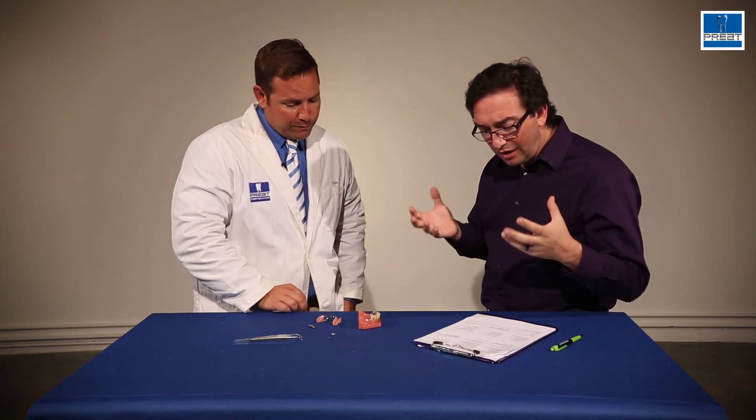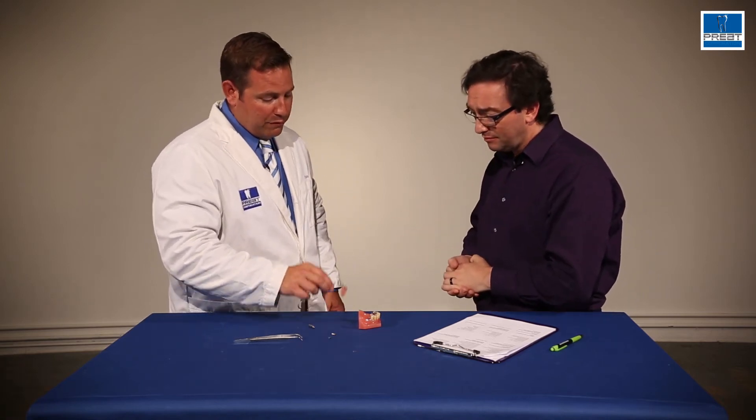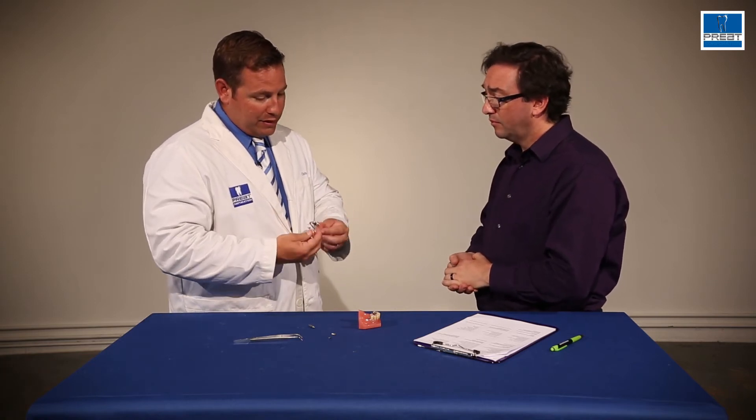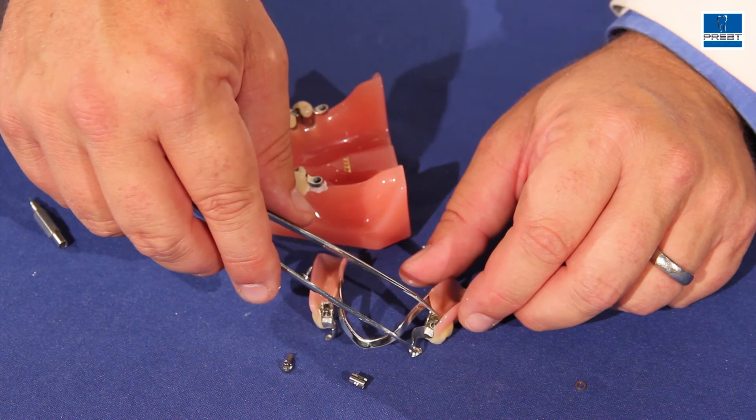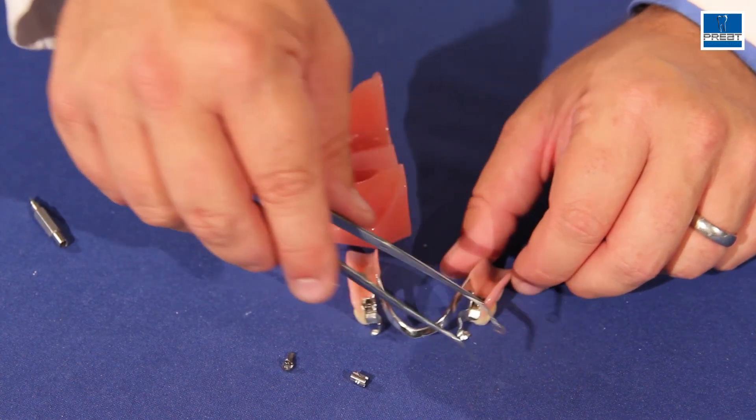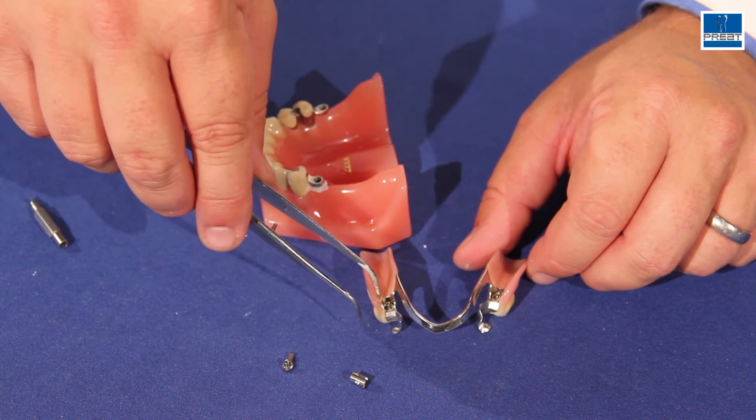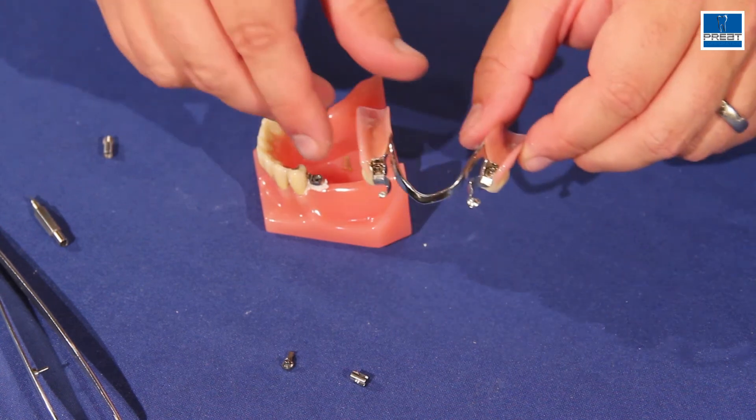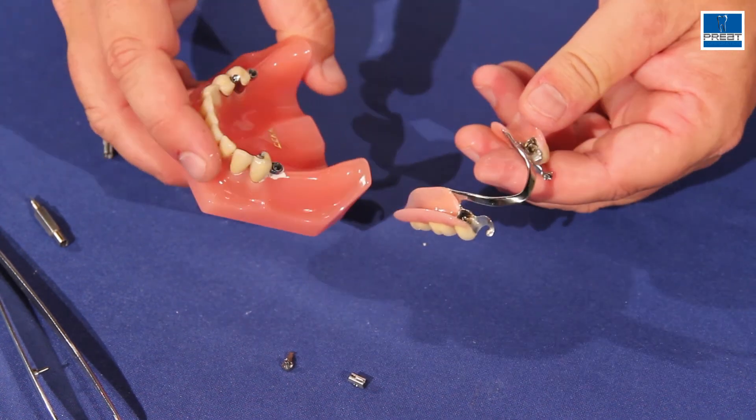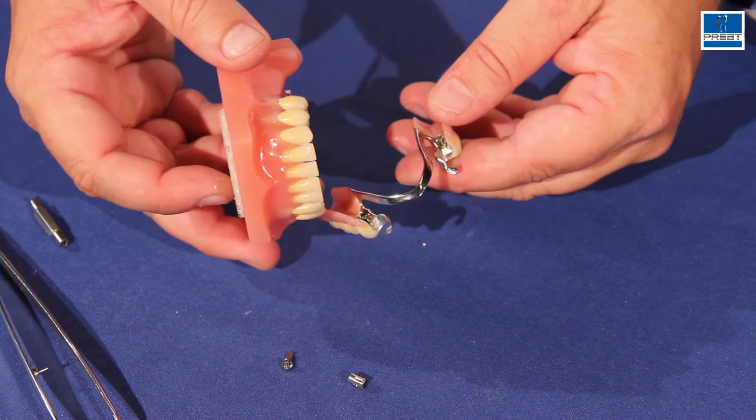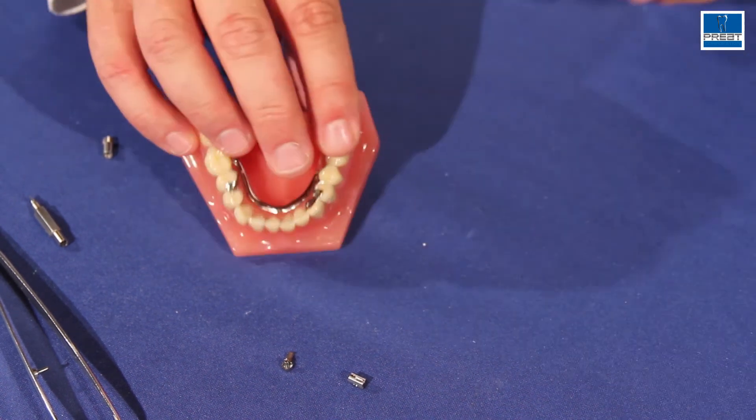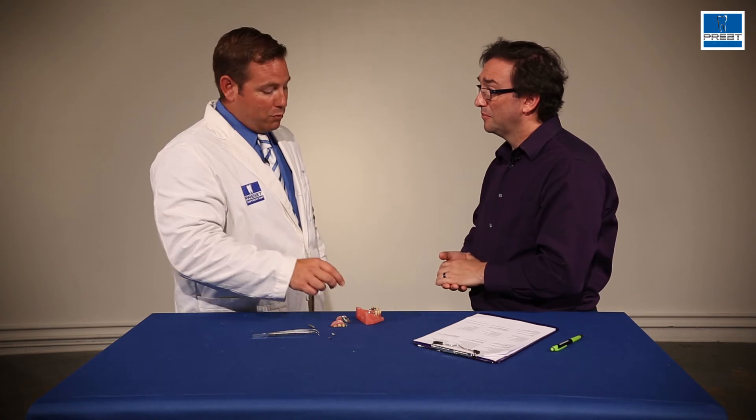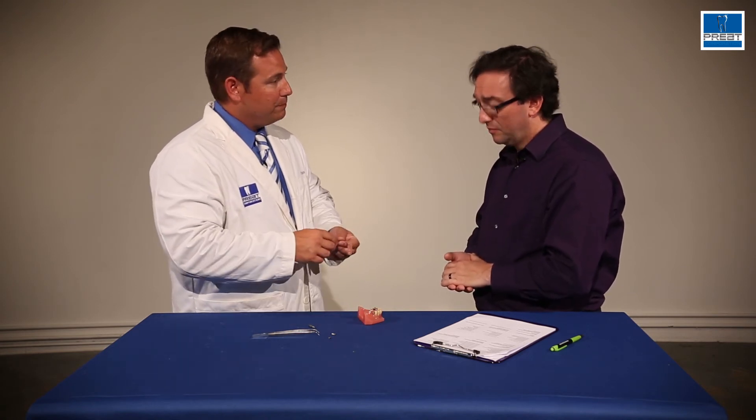The other one would be if we wanted to reline this partial denture. And again, this is a case where using this 694B, the little spacer, is extremely important. I'm going to take the existing prosthesis with the attachments in place. I'm going to place that little space maintainer over the attachments. So when I go to take my wash or reline impression, I have the space maintainers in place. Again, a little dab of petroleum jelly helps hold them into place. So when I'm taking my wash or reline impression, I position the attachments in that resilient position. So it's going to give the correct position of the attachments when we're relining and adding acrylic to compensate for the lost bone and the saddle area.